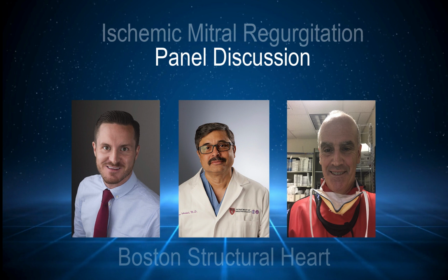She already has a very abnormal inferior lateral posterior wall that doesn't look like it's going to get quite a bit better. And your measurements definitely suggested severe mitral regurgitation. So to leave the operating room with severe mitral regurgitation, or even moderate-plus mitral regurgitation in this patient, I think would be the wrong thing.